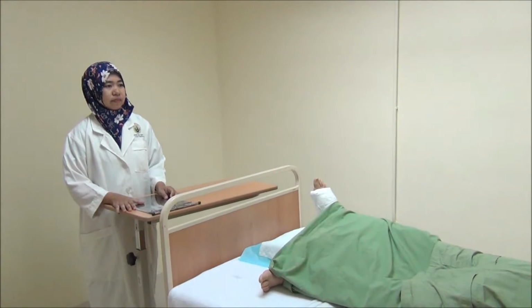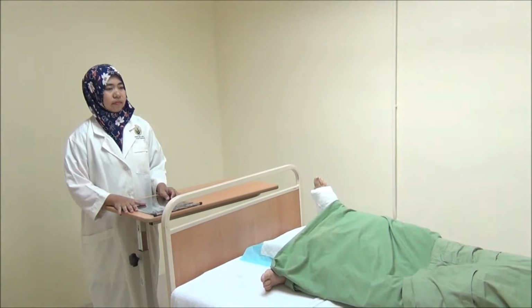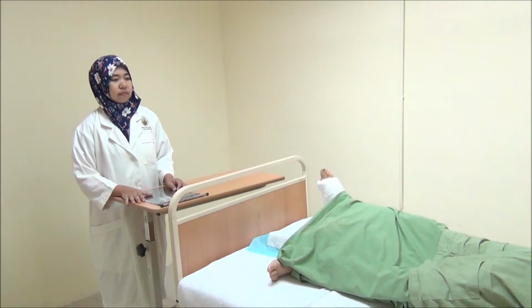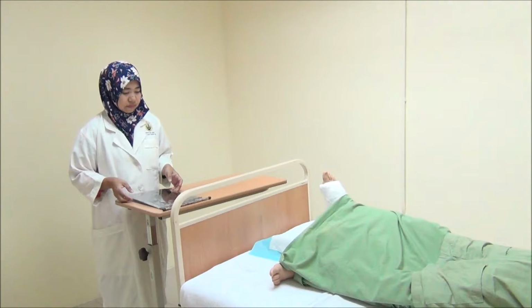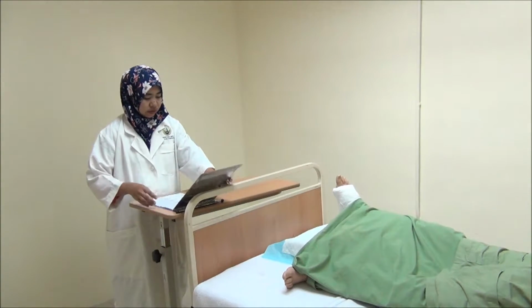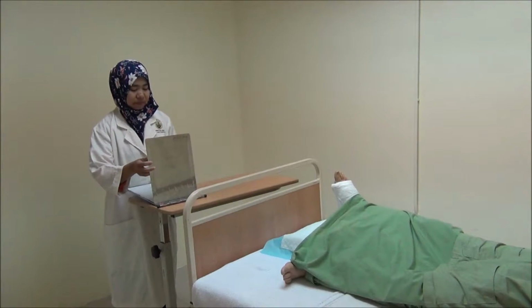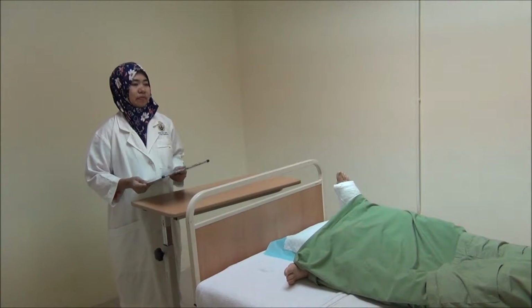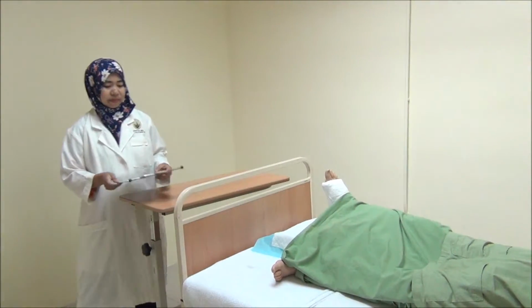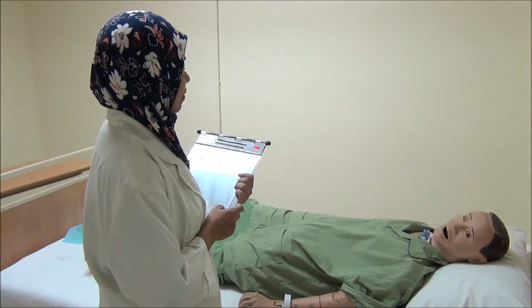Alright, now we will start the practical part of the administration of subcutaneous injection. First of all, you need to prepare. Verify patient and check doctor's order. Check the medication administration record and assume that equipment and medication have been prepared according to the procedure manual or the policy of the hospital. Prepare the environment, ensure the bed is locked and there is privacy.